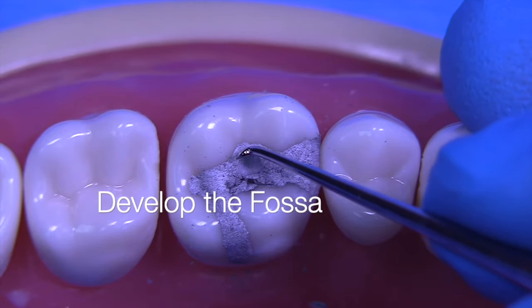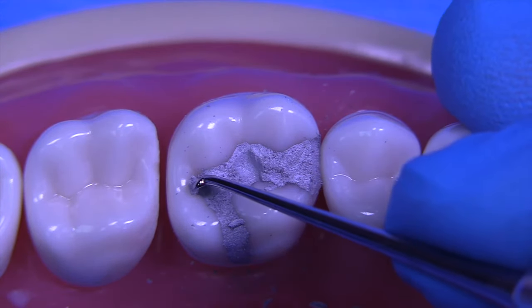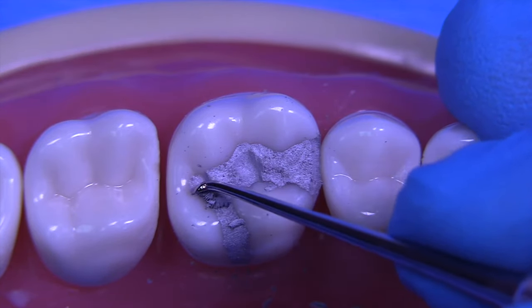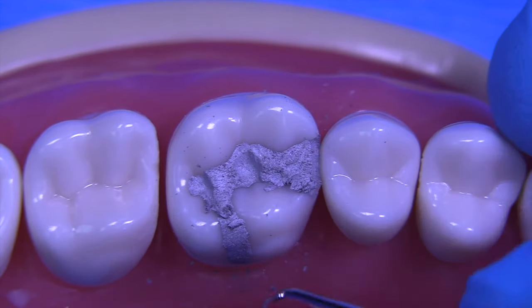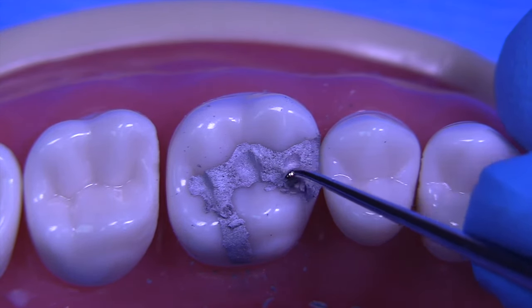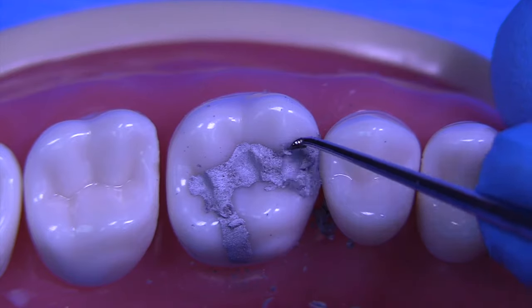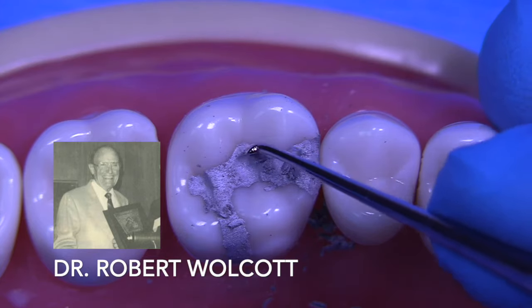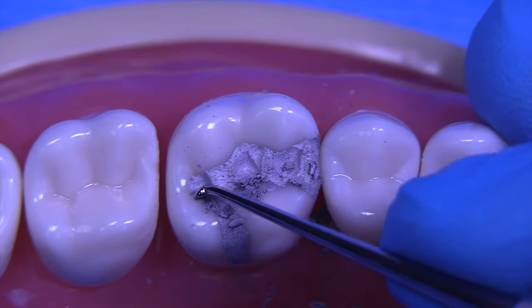Now we're going to scoop out the fossa — we scoop out the central fossa, the mesial fossa, and the distal fossa. This likens to removing a little scoop of ice cream out of a tub, but it's really helpful to make this determination in your mind exactly where you have the low points of the anatomical form. This is one of the most helpful techniques I've ever learned, and I owe it to Dr. Robert Wolcott, who taught at UCLA for many years and was the chairman of operative dentistry at UCLA. Thank you, Dr. Wolcott.